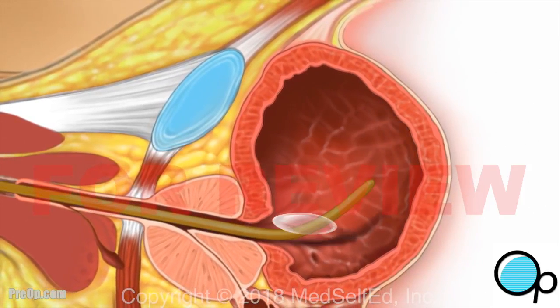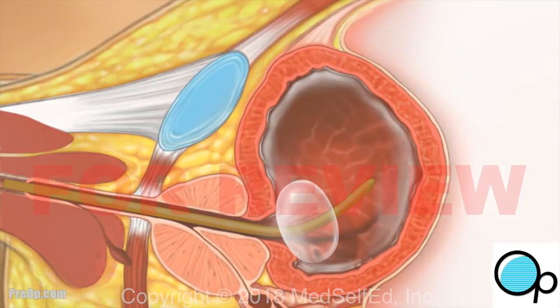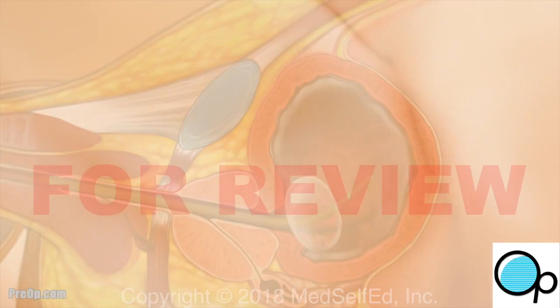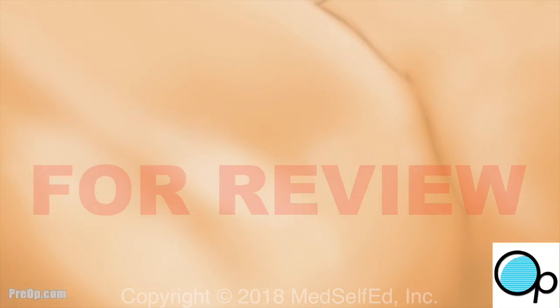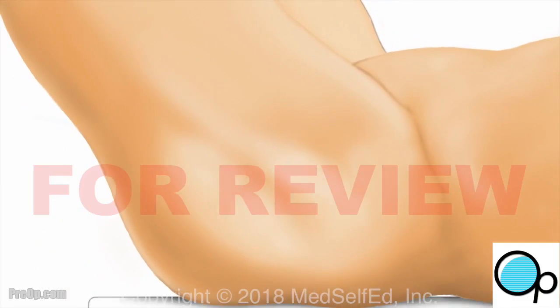A thin, soft tube, called a Foley catheter, may be placed in your bladder. This tube can be used to fill your bladder with chemotherapy as part of the procedure if needed. This chemo or medication is used to prevent loose tumor cells from sticking to your bladder lining. Sometimes the Foley is left in for a few days to keep your bladder empty for healing. When it is time to be removed, the balloon is deflated and the tube easily slides out.